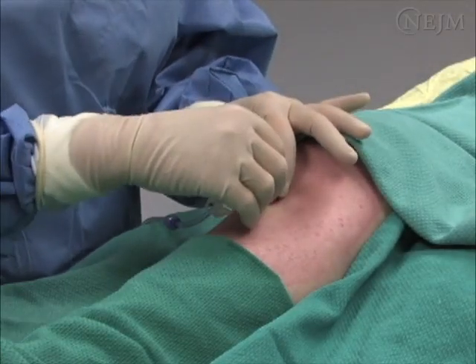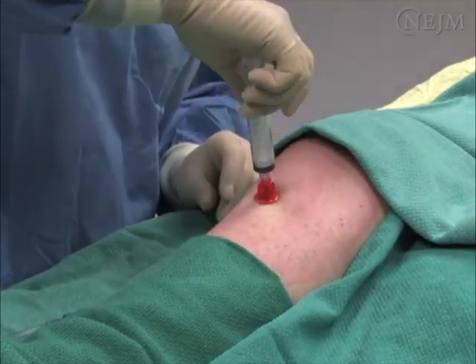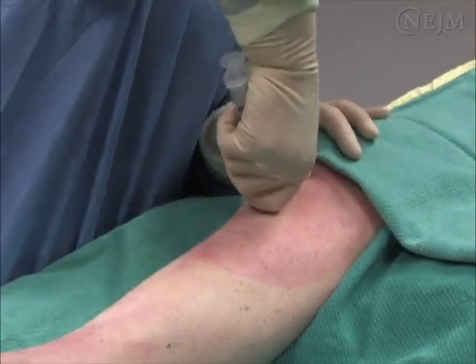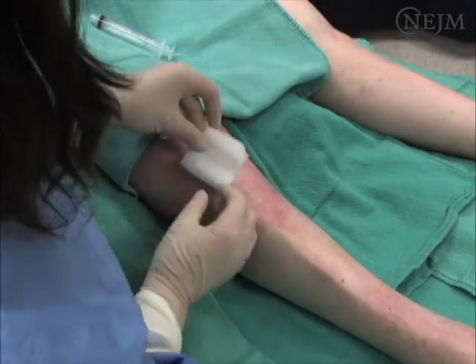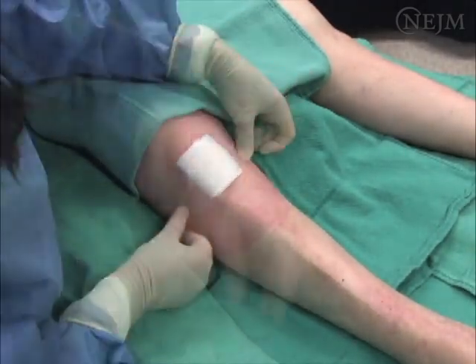Intraosseous needle insertion is used as a temporary measure when intravascular access cannot be achieved through peripheral or central venous routes. The intraosseous needle may remain in situ for 72 to 96 hours, but ideally it should be removed within 6 to 12 hours as soon as an alternative intravascular access has been established.